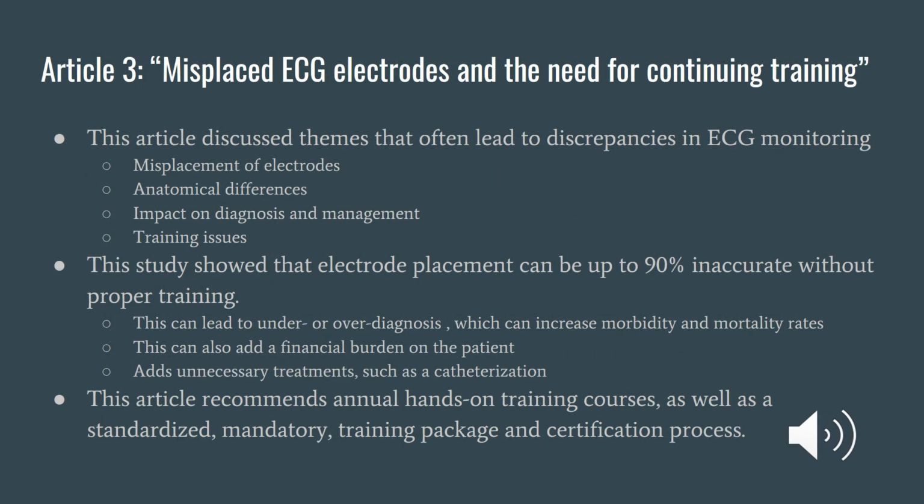Article 3, Misplaced EKG Electrodes and the Need for Continuing Training. This article discussed themes that often lead to discrepancies in EKG monitoring, such as misplacement of electrodes, anatomical differences, impact on diagnosis and management, and training issues.